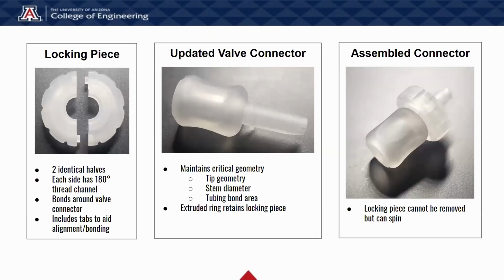First, we have the locking piece, which is the only piece that we've added to the previous assembly. It comes in two identical halves, each with a threading track cut into it. The locking pieces assemble around the stem of the valve connector. You can see on the valve connector in the middle that there is a circular shelf that keeps the locking piece in place. So it can't be removed axially, but it can still spin.